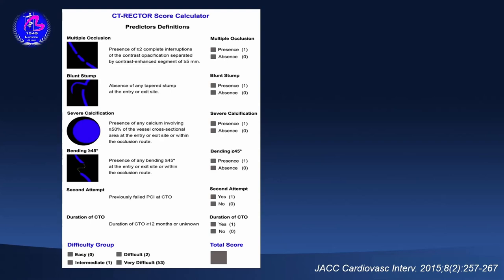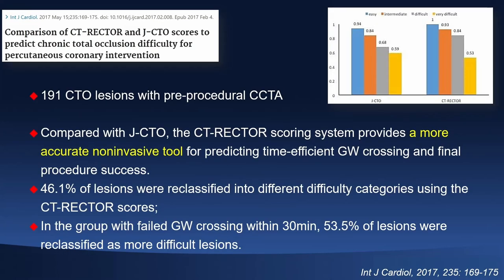And the next, certainly no severe calcification for this case. And the first try failed 1 year ago, and certainly the duration of the CTO lesion should be more than 12 months. So if we use the difficulty, very difficult. Okay, next. So this is a study from a Chinese center.